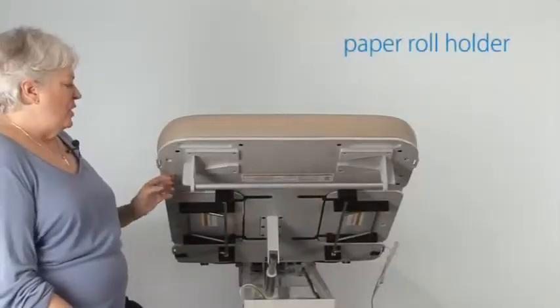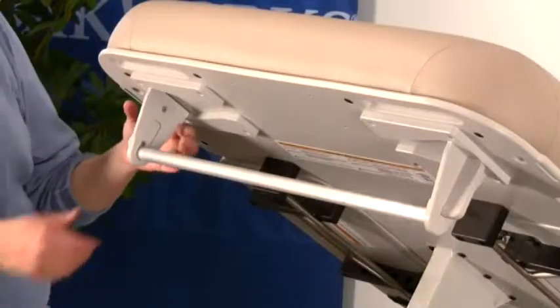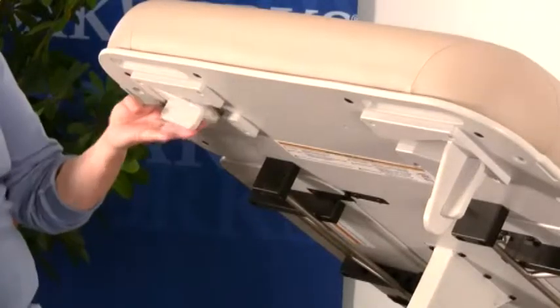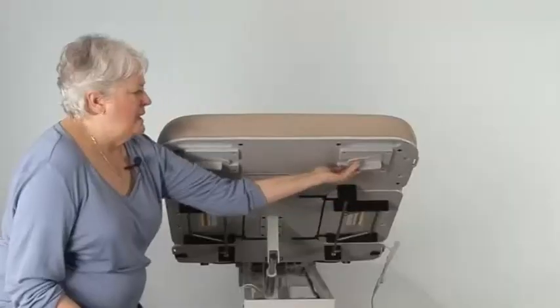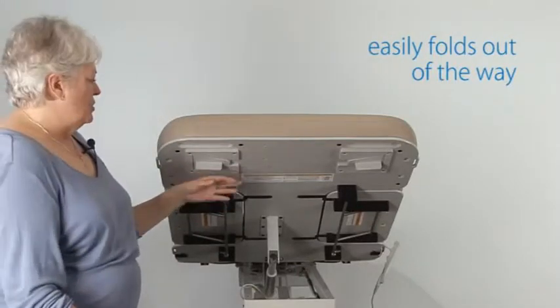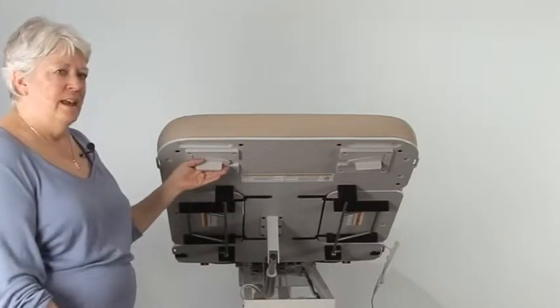A standard feature on all the exam tables is a paper roll holder. This can actually be removed and the brackets that hold the bar can be folded back against the table top. This allows sonographers to come in under the table top without obstruction to their knees if they're scanning from the head of the table.